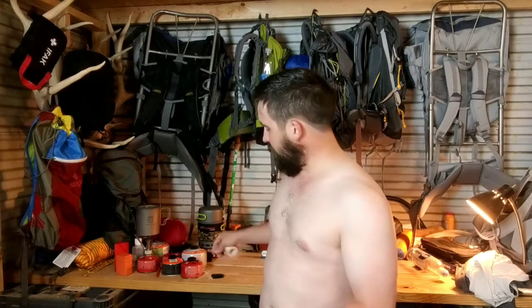Anyway, you're going to take your alcohol prep pad and clean up all the blood in their sucking chest wound, right? You're going to try and get the area as dry as possible. If you need to, use one of the gauze pads. It's already in our first aid kit.